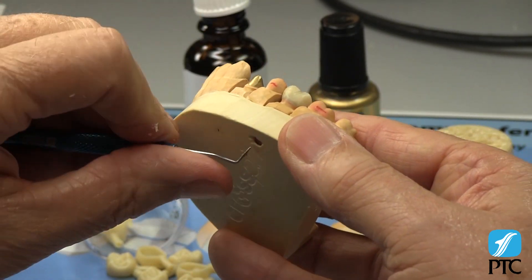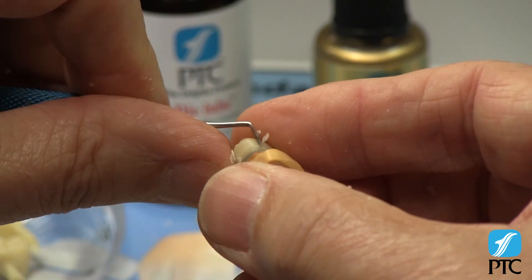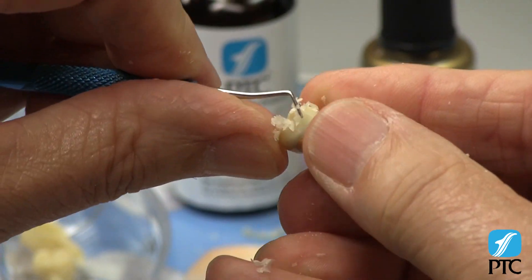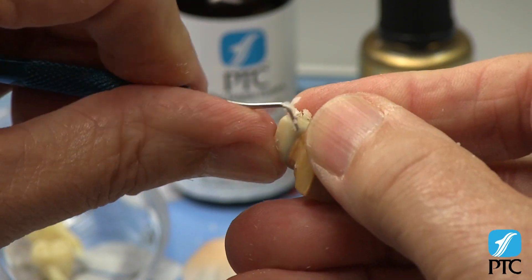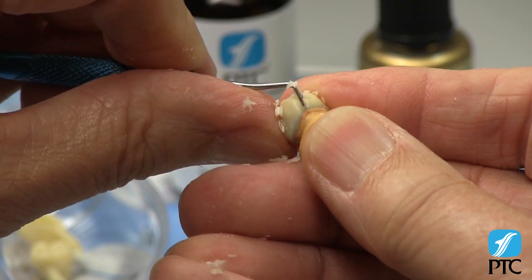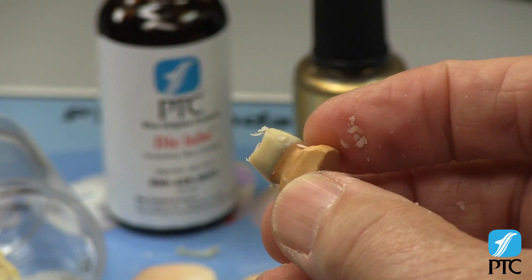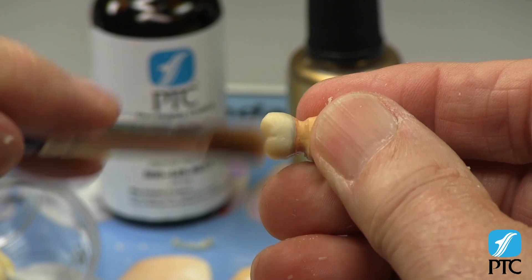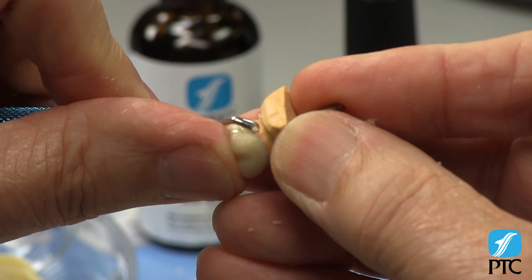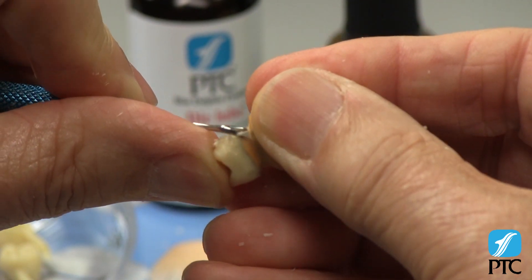Remove the die and refine the emergence profile of the pattern. Reduce any excess wax at the corners of the crown at this time. Carve a perfect margin by using the A carver end of the PTC WC1 carver. This procedure is shown in detail in the PTC Perfect Margin Carving video.